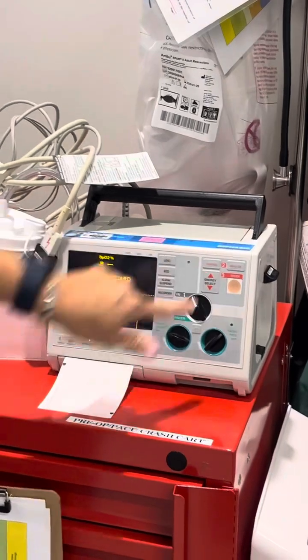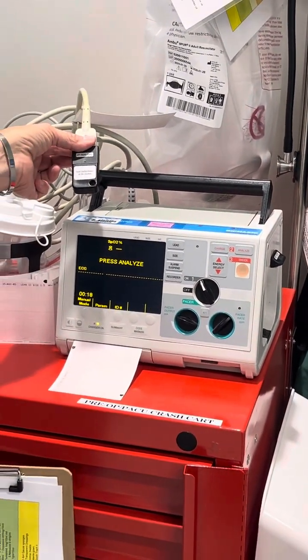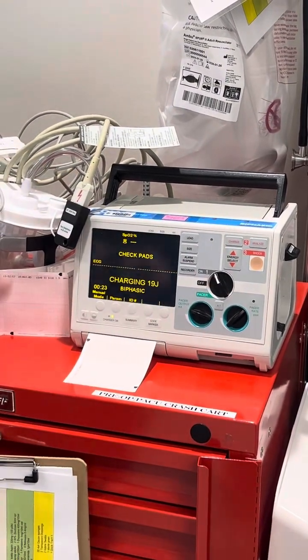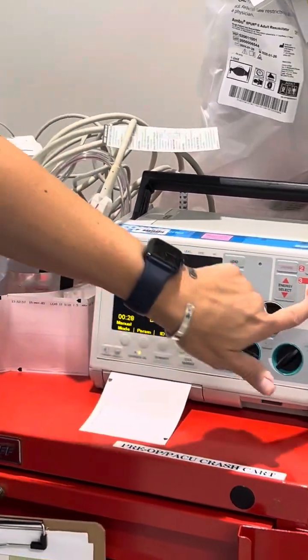Go ahead and charge it. Make sure you're plugged into your device. It's analyzing it. You're going to hit your analyze button. It's going to charge your pads. You'll see this says 30 joules — that should charge to 30 joules.